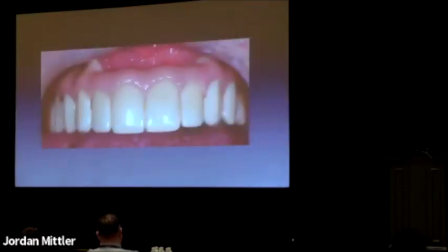And then in this case, we put some pink porcelain on it, simply more as an experiment. This is something we did a while ago. This was one of the first zirconias we milled in office. And cosmetically, it's not the greatest result you've ever seen, but it was adequate. And you'll see how much of this you actually see in the patient's mouth. It's almost a moot point. This is more a functional restoration for him than it was aesthetic.